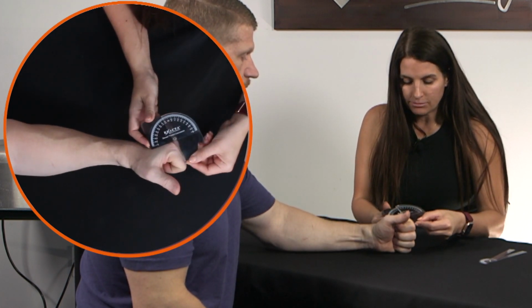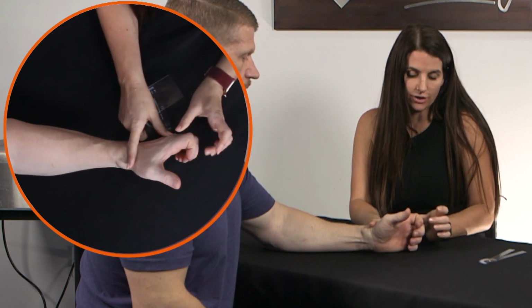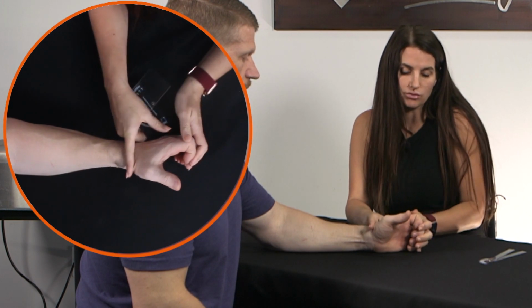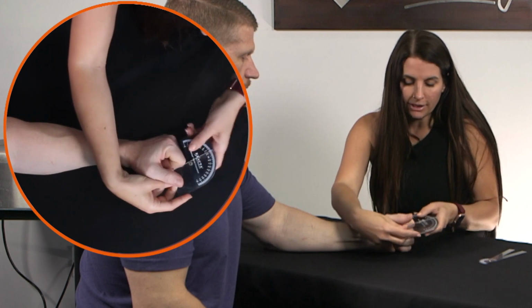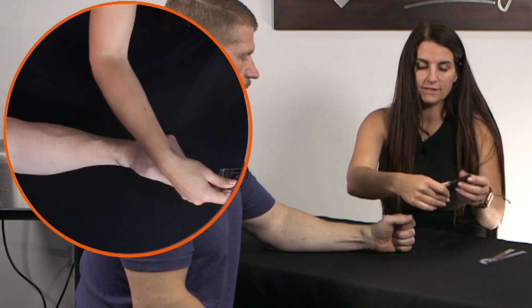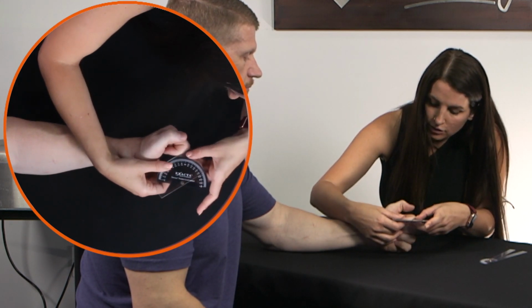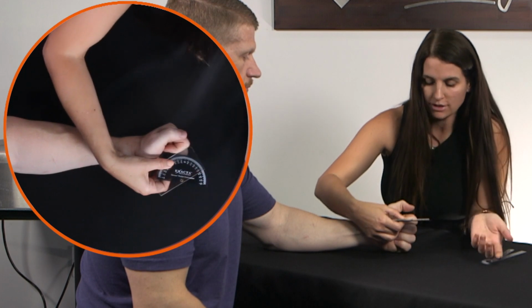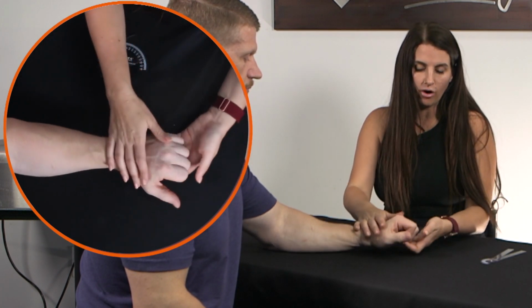So at the MCP joint, he is at 84 degrees. Now, if you wanted to come up and measure him like that, that would not be the standardized way. So if you do that, you need to notate why you're doing it that way so you're consistent. And then you would measure the PIP, 72 degrees. And then the DIP, which is 40 degrees. And you repeat the same measurement for all the other digits.